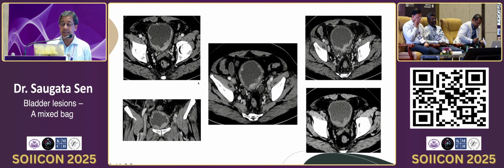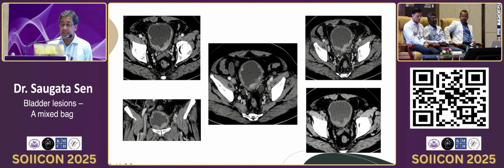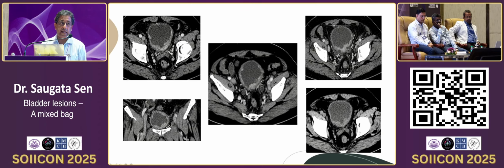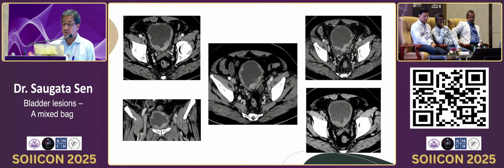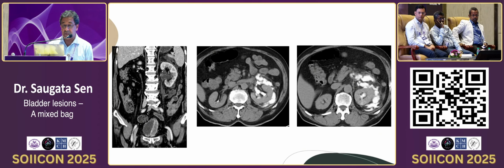And here's another lesion which is kind of plaque-like, enhancing and multifocal. So you can see the involvement is probably all over the bladder, and the urologist really has a hard time to take out everything. Oftentimes these are infiltrating into the muscle and out of the bladder, so a radical surgical option is curative for the patient, or that's offered to the patient.